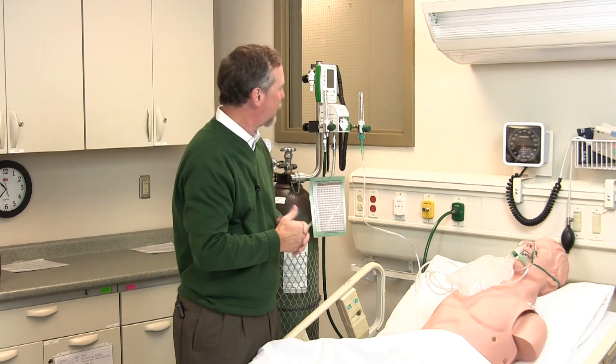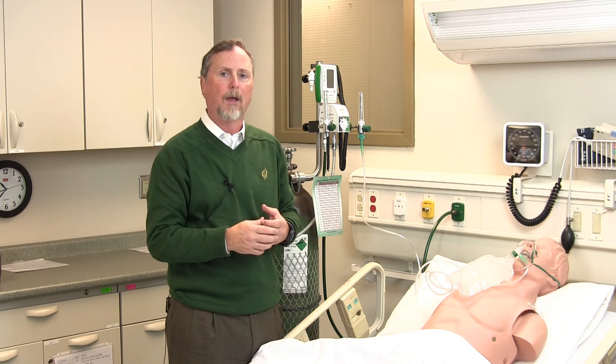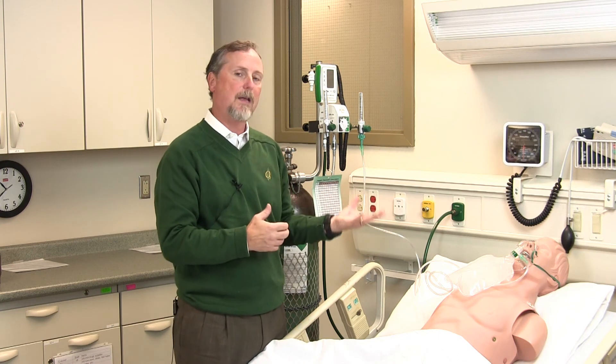So in this case, we're at about 20 liters per minute at 40% oxygen. We're going to monitor our patient, check their pulse oximetry, and look for signs and symptoms of respiratory distress going away. The primary indication is to overcome airway obstruction. There's evidence out there for COPD, asthma, bronchiolitis in children, RSV, croup, upper airway stridor, and aspiration of foreign body — conditions that cause narrowing and difficulty of gas passing through the respiratory system. Those are the cases where you'd want to consider Heliox therapy.